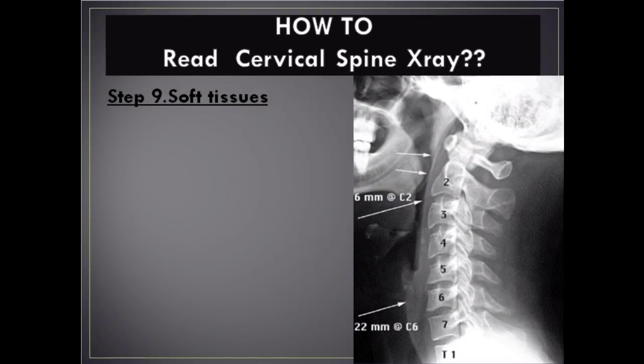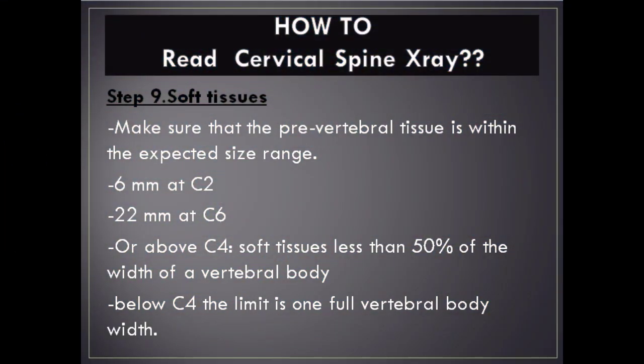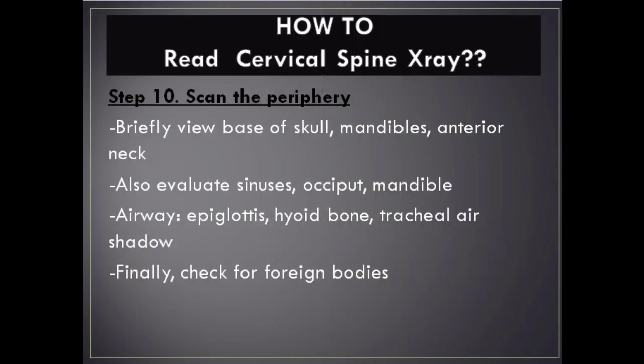Step 9 – Soft Tissues: Make sure the pre-vertebral tissue is within the expected size range — 6 mm at C2, 22 mm at C6, or less than 50% of the width of a vertebral body above C4. Below C4, the limit is one full vertebral body width.